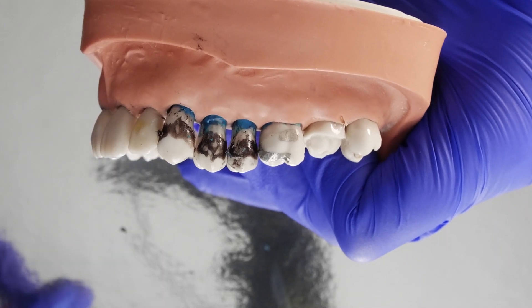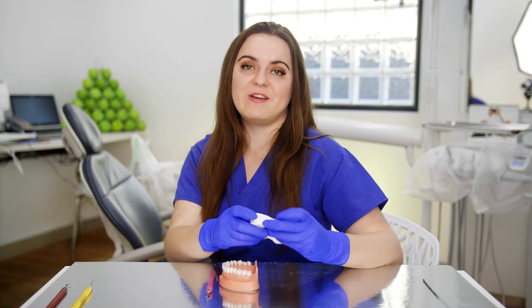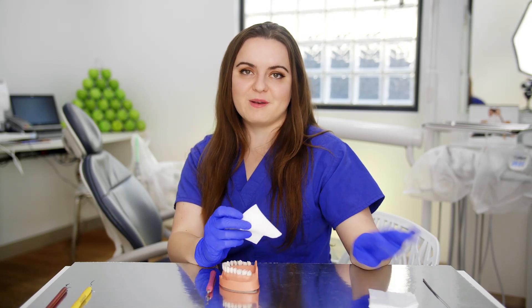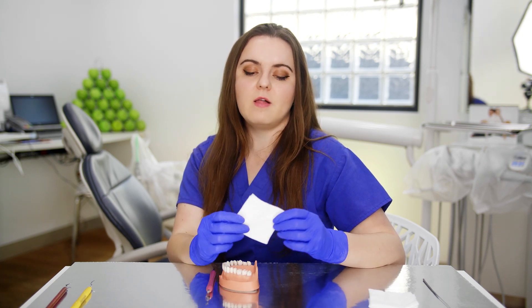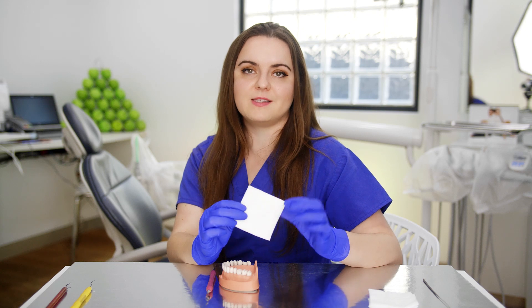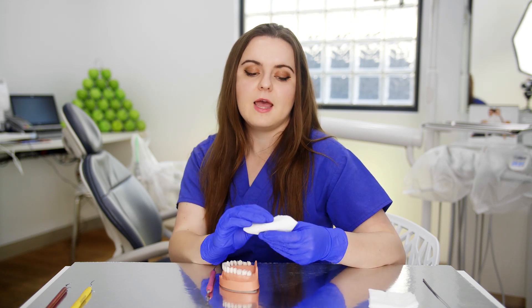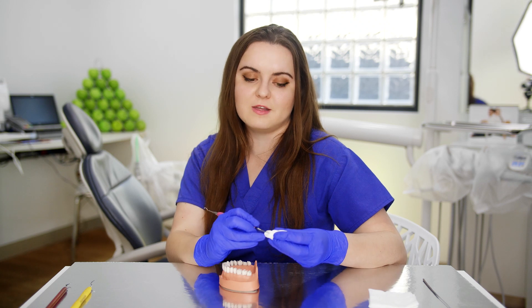Moving on to the next tooth — short sharp strokes all the way to the back. Start in the midline again. This is an oblique stroke now. And you just keep on going like that until all of that calculus is gone. Obviously as you're doing this, you're also going to need some gauze to wipe the instrument because there's going to be blood and calculus deposits on there. I like to use a 7.5 by 7.5 non-woven gauze — it's nice and thick. When I use it, I fold it up so that you're less likely to prick yourself. Be really, really careful and make sure you don't cause yourself an injury.